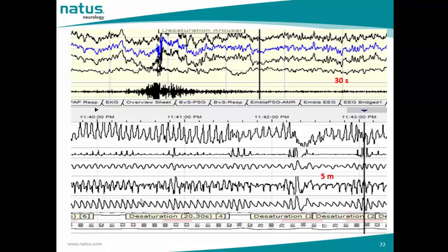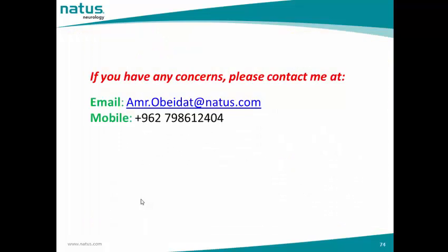This is another example. If you look at the indication bar on the EEG channels, you can see that it is preceded by evidence of arousal. Respiratory-wise, we can obviously see that the indication bar is preceded by a respiratory event. If you look at the PTT signal, you can see that there is a remarkable drop in the amplitude, where the amplitude increases until the event is terminated.